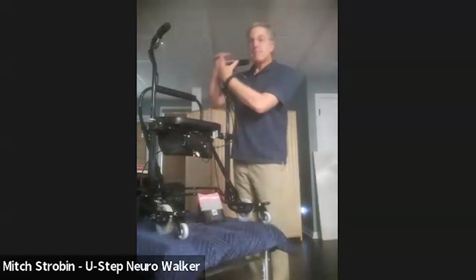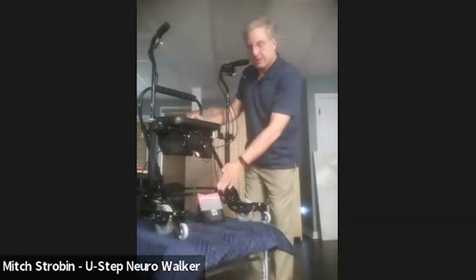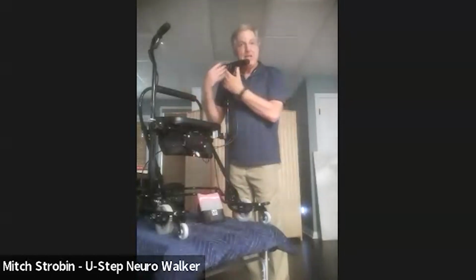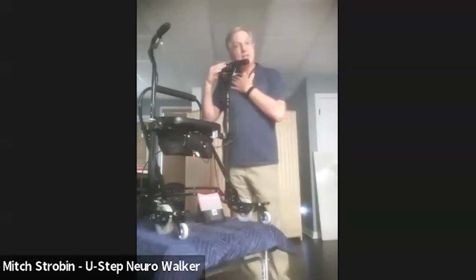So with this module, we have visual cueing with the laser, but there's also a built-in metronome. Because we know people like to listen to music or a beat sometimes to keep a rhythm when walking. So I'm going to turn on the metronome, and it's very easy. With the laser on, I'm just holding in the top black button for 4 seconds.